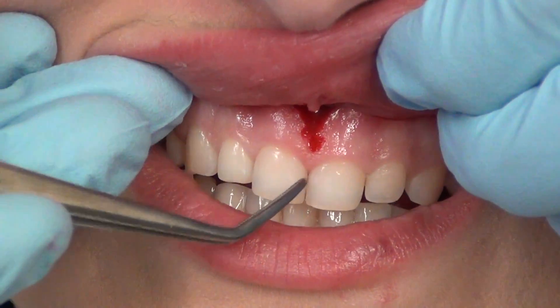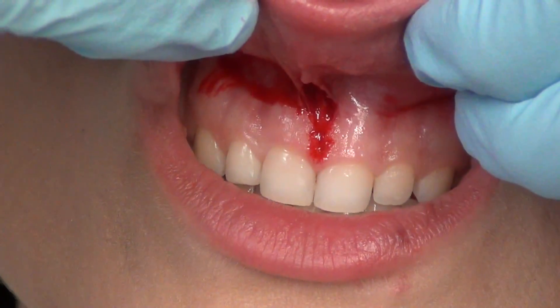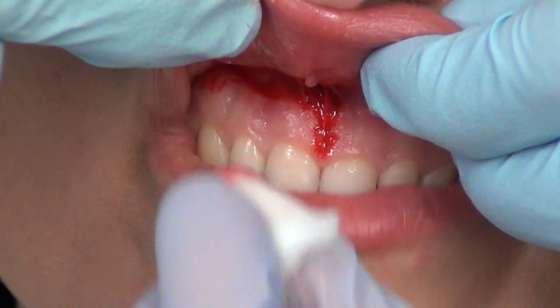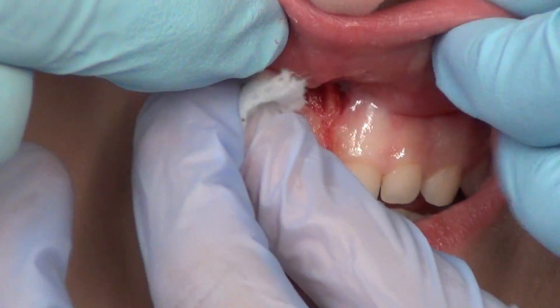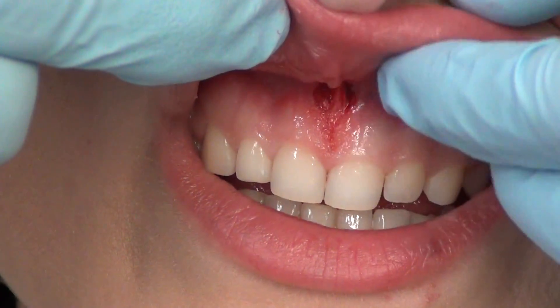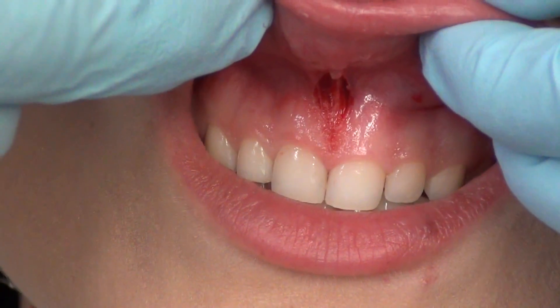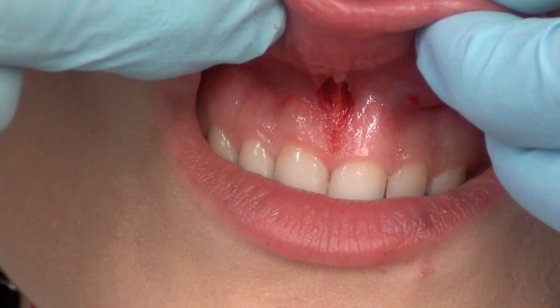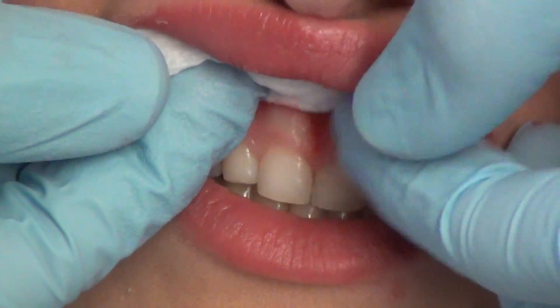Now it's over there. So now when I smile it'll look better. This piece here was attached right here and now it's not. That bump is gonna go away — it'll basically be smooth like here. She's gonna heal. I could cut more but I think that's just enough. I'm gonna leave this one in there.